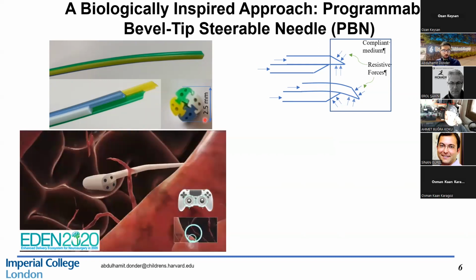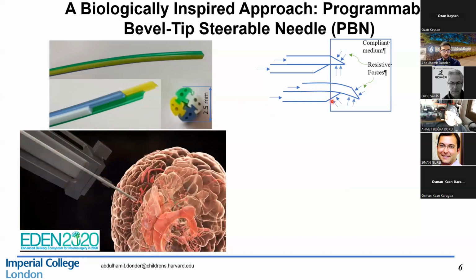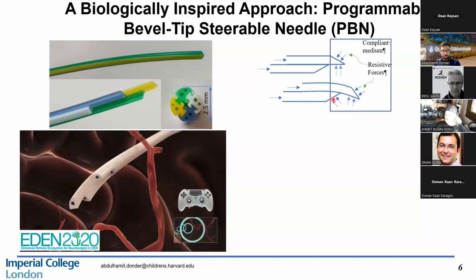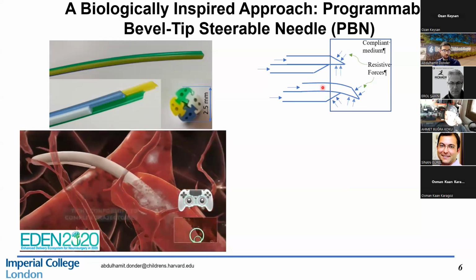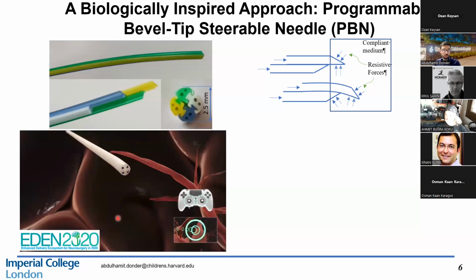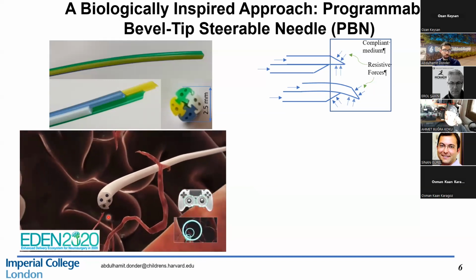And each segment has two working channels, which could be used for a variety of purposes, such as sensorization and drug delivery. And the steering could be achieved in this way. Here it curves down because of the asymmetric forces at the tip, as seen here. However, if the bottom segment was made the leading segment, it would curve up. So many curvatures could be achieved one after another. Here is a video illustrating the navigation of the needle. As you see, to change the curvature or the bending plane, no axial rotation is required. Therefore, it could be made of more compliant materials, as it doesn't need to transmit the torque from base to tip to rotate it.